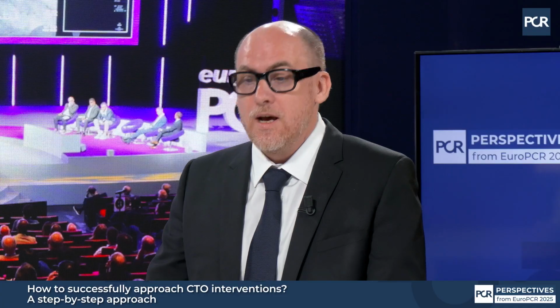And most of all, after all that, I will stop. I will not start my CTO right away after the angio. I need to think, to see the images again, stop the angio and discuss the CTO.